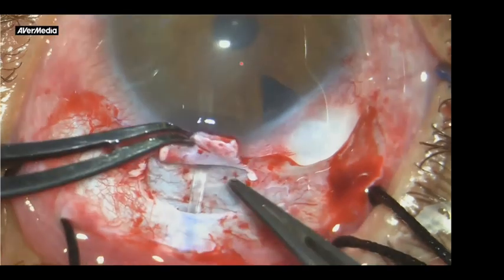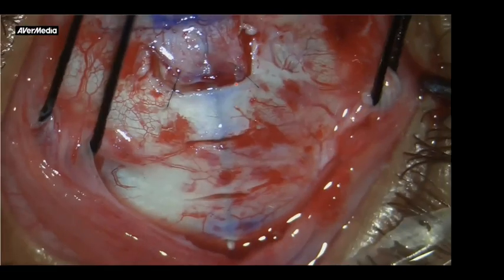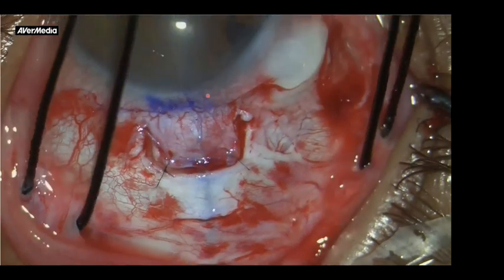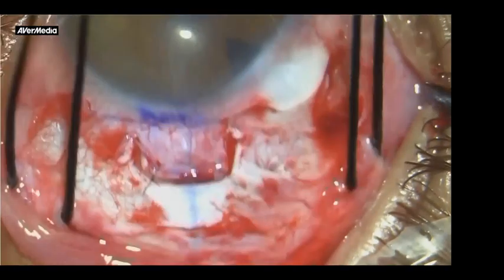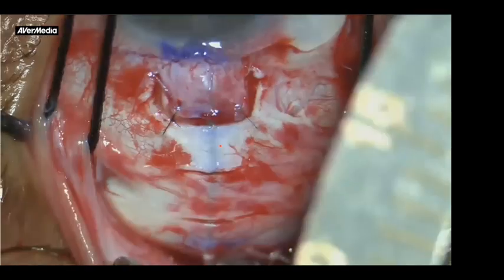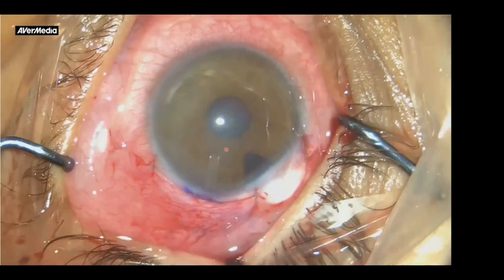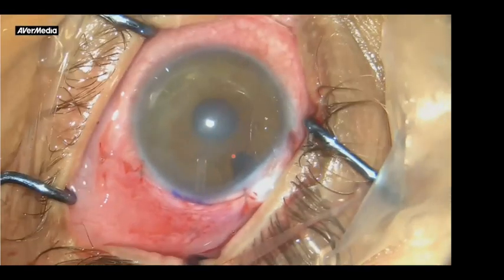It's congenital glaucoma, you see recurrent, and I apply two sutures. Now, if the tissues are very thin here, I'll put a scleral patch graft. If the tissues are good, so that now I'm satisfied, I will not do anything. And sometimes the implant is even greater than 12 millimeter.